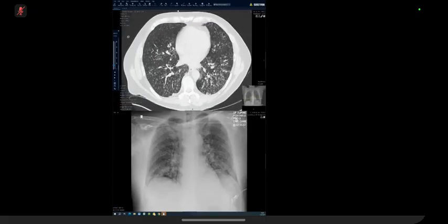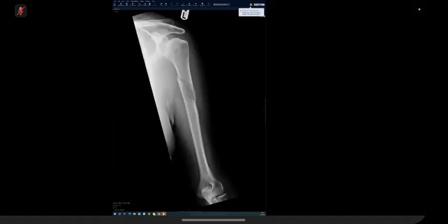Okay. And is that a reportable disease in terms of infection? Do you need to highlight that? Yes. I will immediately communicate these findings to the referring clinician, as the patient needs to be isolated till the anti-tubercular treatment is started, as the patient could be communicable in the interim. Okay, perfect. Let's do one last one.